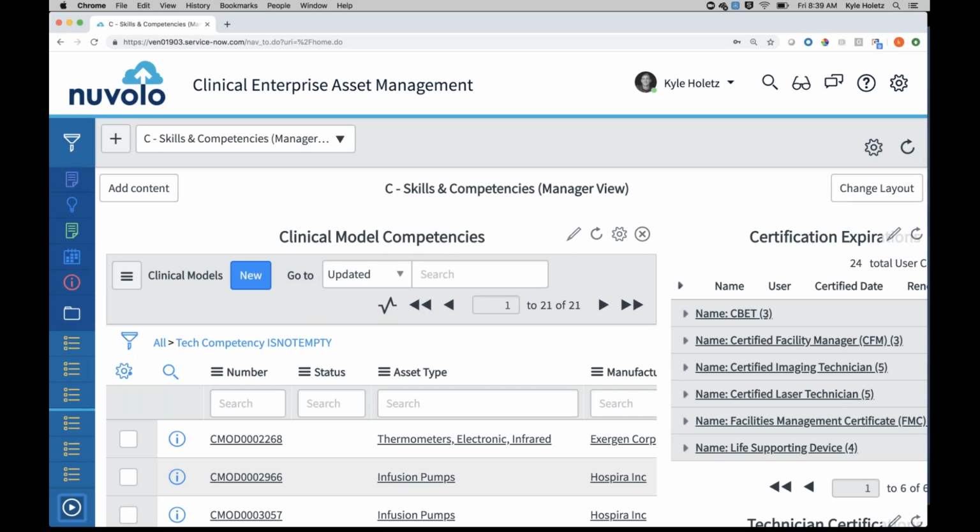That's hard to do just by having a work order with correct maintenance and flows, because anything could happen on that work order. Tying it into competency is not a bad idea, but you'd need a checkbox or a couple that the technician could put down: repaired unit with no assistance. And even if they repair it with assistance from OEM, we're all about uptime today. It's not about, oh, I fixed it myself, didn't need any help. I fixed it, got this thing up.